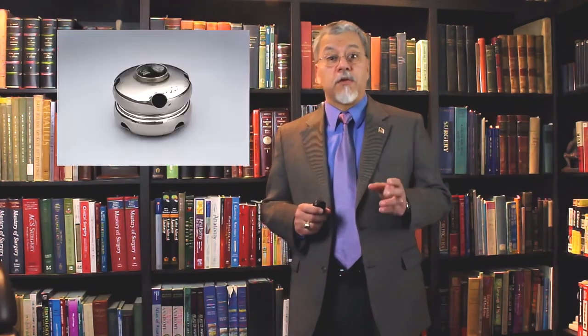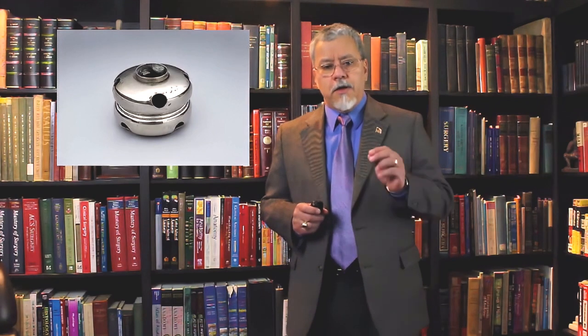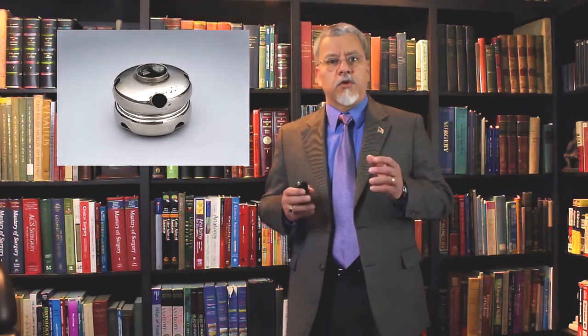And speaking of sutureless, Dr. John Benjamin Murphy developed a compression anastomotic device or ring that became known throughout the world as the Murphy button. And this device is the precursor of all the compression anastomotic devices in use today. But that's another story. Let's go back to stapling.